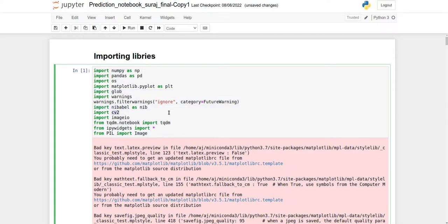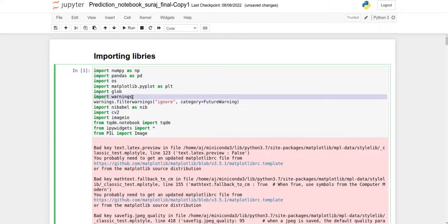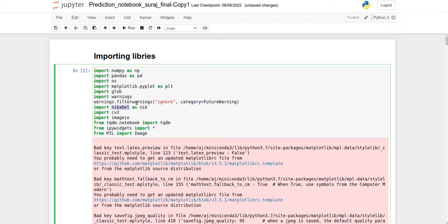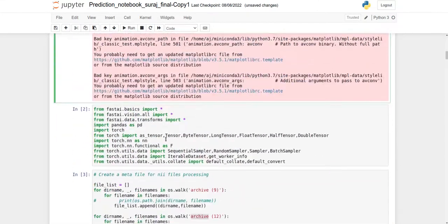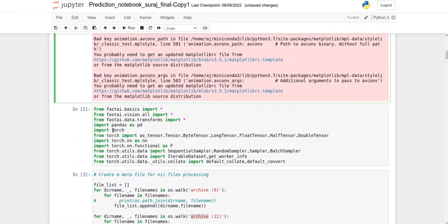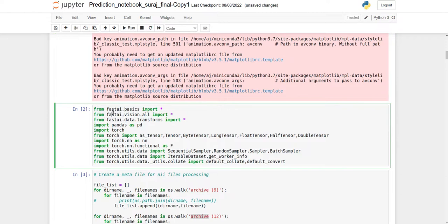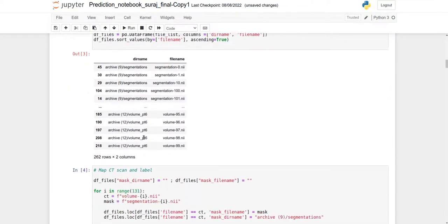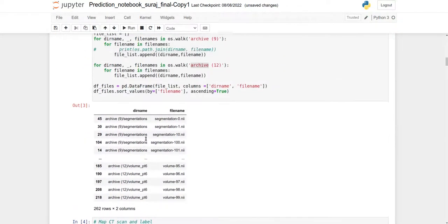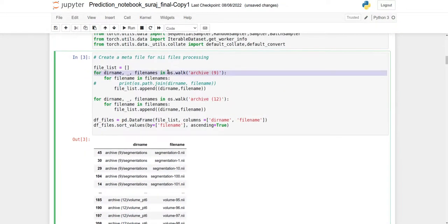The entire source code is simple. Import libraries like NumPy and Pandas - I believe you already know basic Python, so I won't waste time explaining basic syntax. Import NiBabel because it's important for handling NIfTI medical imaging data. We'll use FastAI and PyTorch because FastAI provides a segmentation model, so we don't need to create one from scratch.